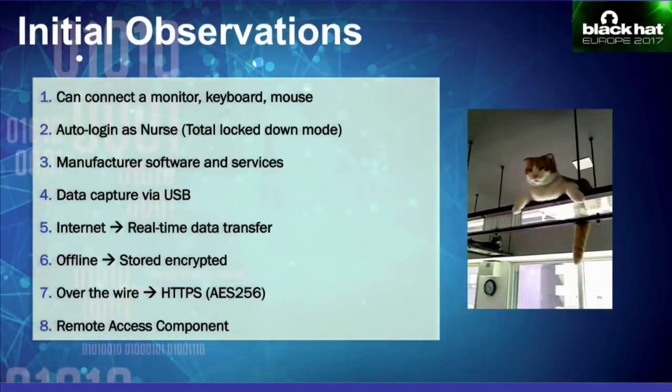When the doctor is writing the prescription, if the pen is connected to the internet, then the data would be transferred to the pharmacy in real time, right then and there. If it's not connected to the internet at that point of time, it encrypts the data and temporarily stores it on the disk. And then when the pen connects back to the internet, that data is transferred.